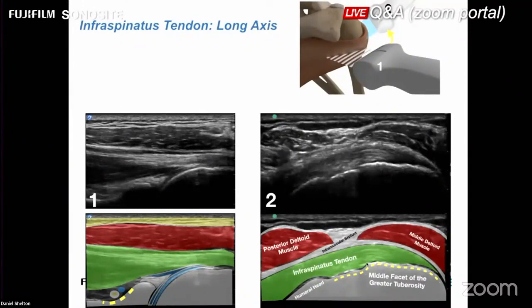One pitfall when you're scanning the distal infraspinatus tendon, as that tendon wraps around, you may get this dark shadow in the center of the tendon, and very commonly you're going to be scanning under this little deltoid septation here. This connective tissue can lay down kind of an edge artifact on each of its sides, or just the sheer change in density going from a fluid-filled muscle on both sides to a relatively less than fluid-filled, densely connective tissue structure.